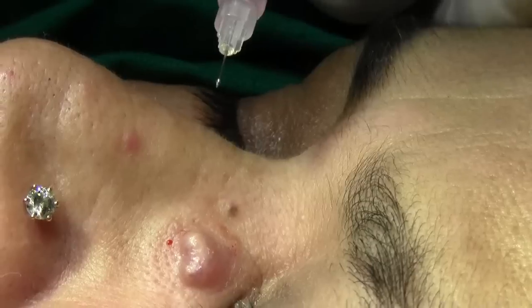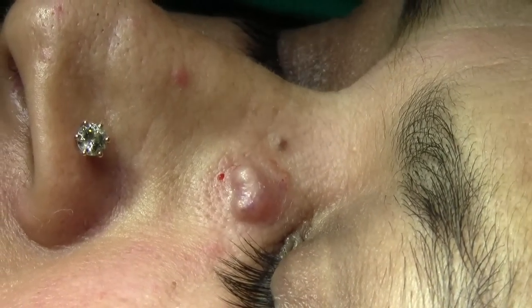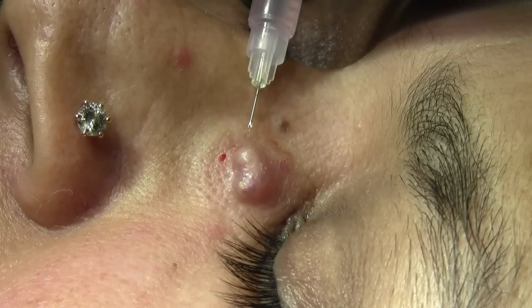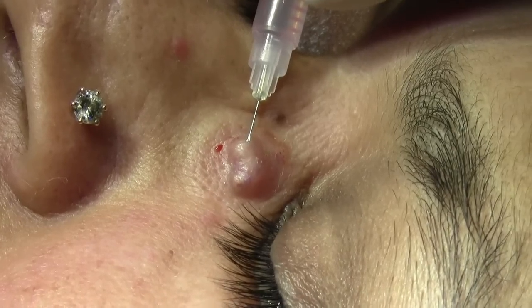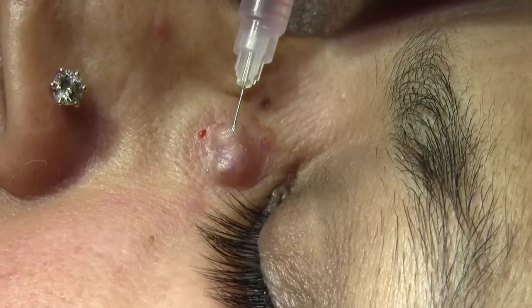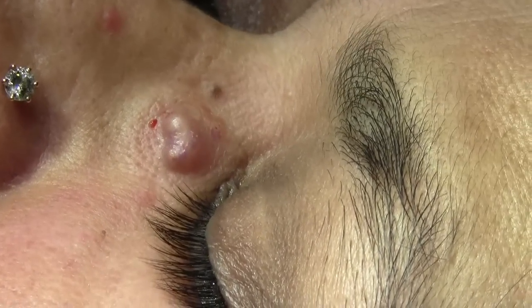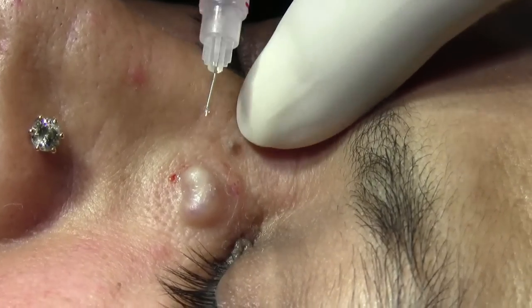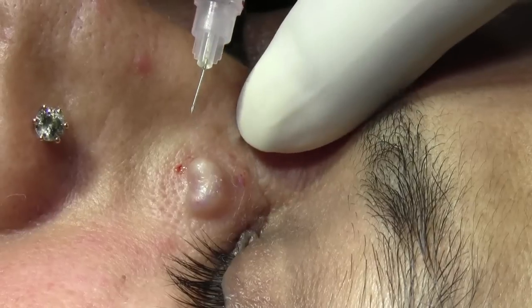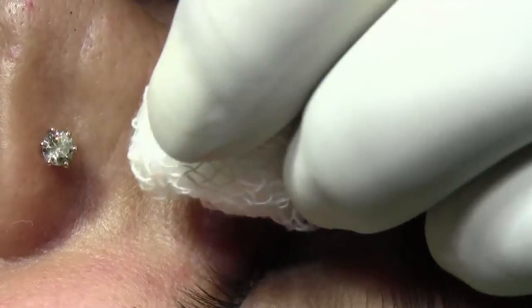The cyst wall is very thin and atrophic. I have already given the local anaesthetic solution here. I am trying to do hydro-dissection. The thin atrophic skin has just volumed up from the cyst wall, separated with the help of local anaesthetic solution.